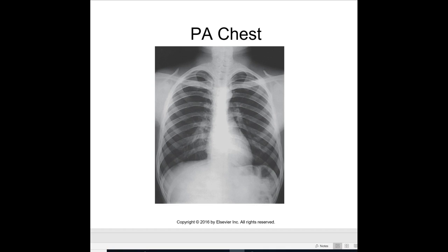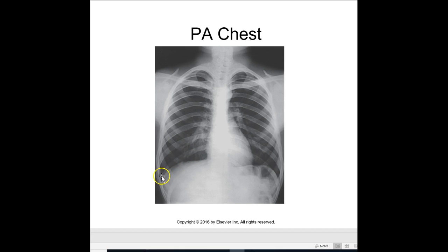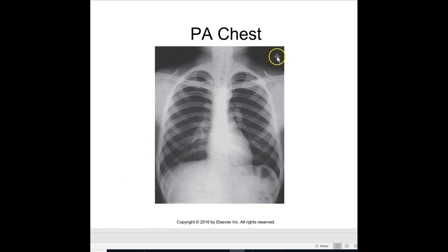This is what your chest x-ray should look like. Counting the ribs: 1, 2, 3, 4, 5, 6, 7, 8, 9, 10. An ideal chest x-ray with deep inspiration shows 10 ribs visible. You can see the apices and the costophrenic angles collimated on the side. The only thing missing here is the marker — you need to have your left marker on the image.